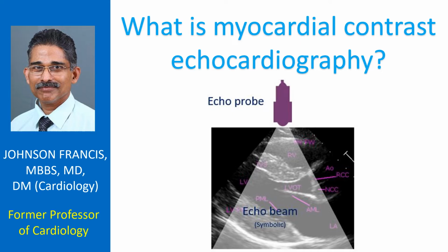These microbubbles are destroyed by high-energy ultrasound. The rate of microbubble replenishment within the ultrasound beam is measured and represents the mean red blood cell velocity. Normally, the ultrasound beam fills within 5 seconds when the resting myocardial blood flow is normal. If it fills slowly, it means that myocardial blood flow is reduced. It will fill faster when there is hyperemic flow.